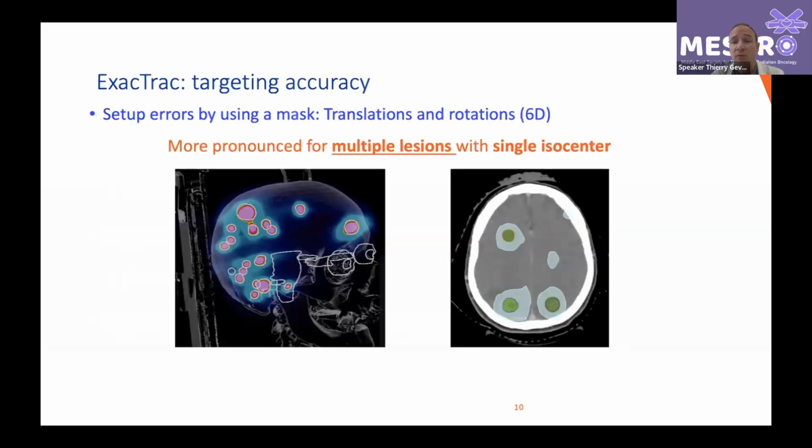So regarding brain, we have a philosophy in our department not to go for whole brain radiotherapy anymore, but to try an approach where we treat only the lesions. So we do stereotactic radiosurgery up to 15 lesions in a single fraction. And so that's a bit our concept. And so that's why, as you can see on those images, you treat a lot of lesions.